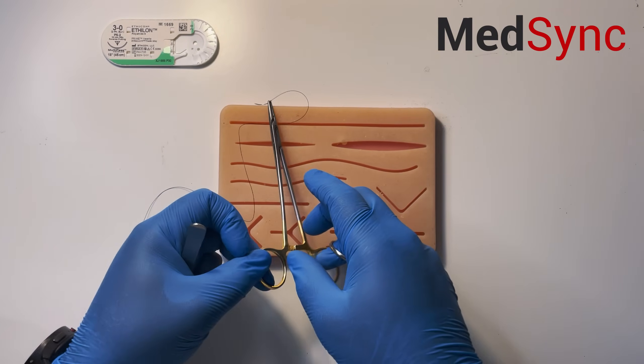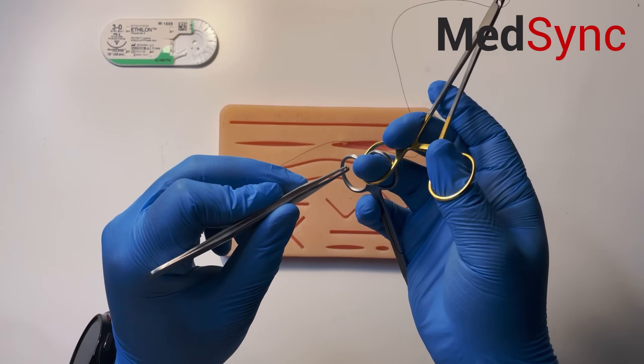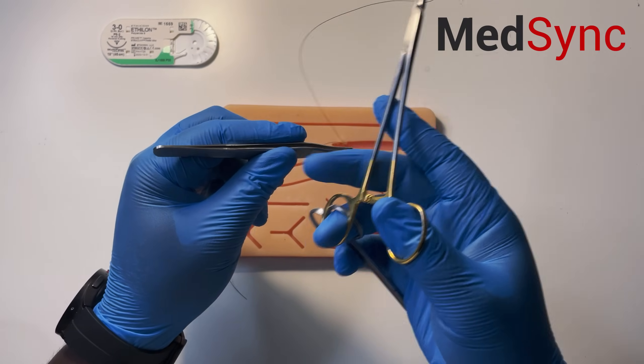You mount your needle holder in the usual fashion. You take your forceps - ring finger and thumb, index finger and thumb.